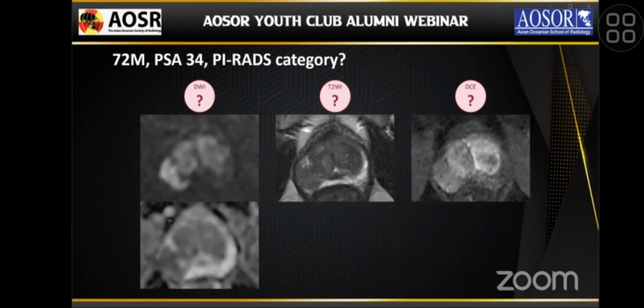Let's move on to the next case. Please score each sequence and the overall PI-RADS category.